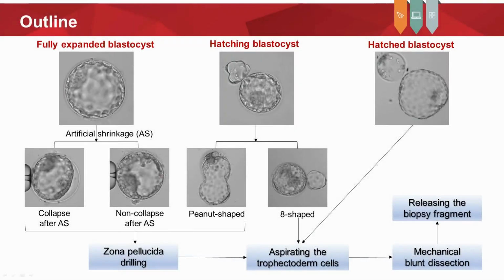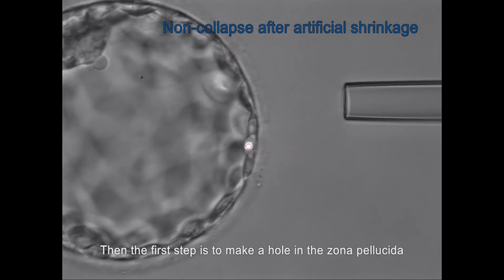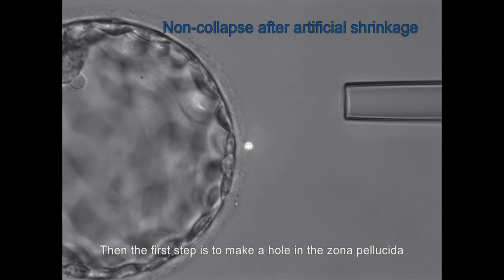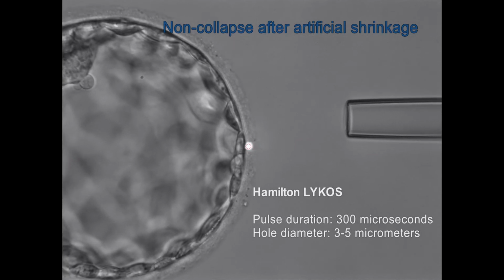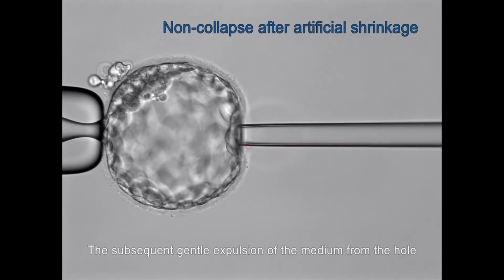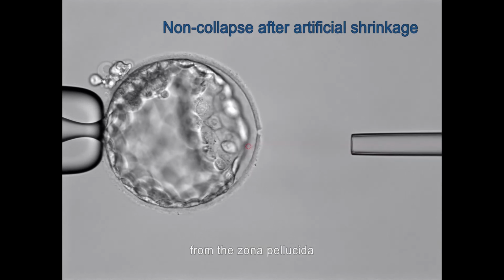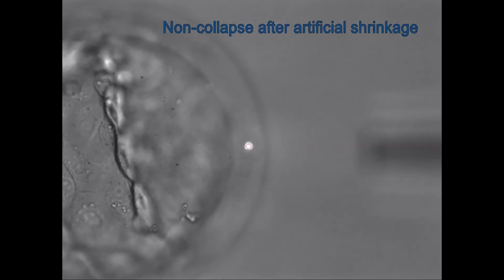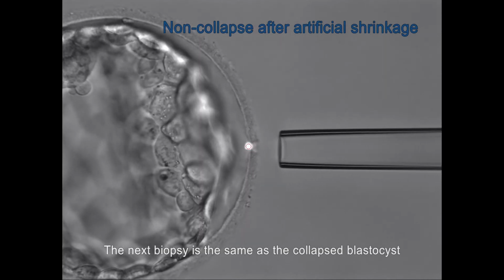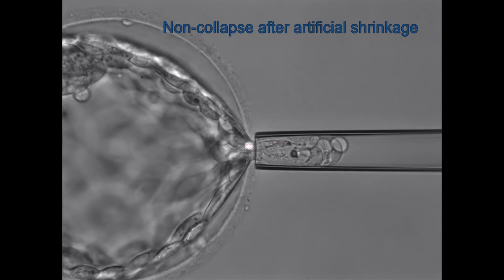If the blastocyst is not collapsed after artificial shrinkage, then the first step is to make a hole in the zona pellucida. The subsequent gentle expulsion of the medium from the hole will separate the trophectoderm cells from the zona pellucida. The next biopsy is the same as the collapsed blastocyst after artificial shrinkage.